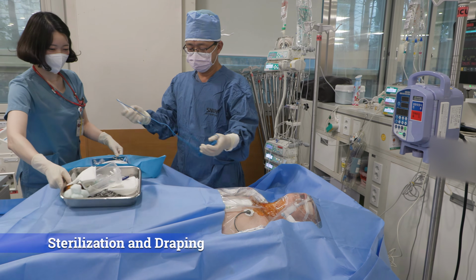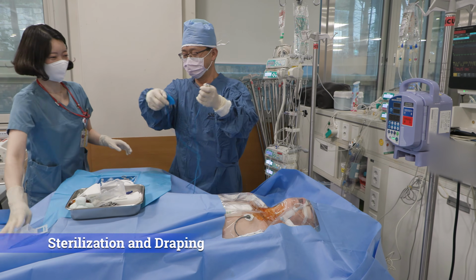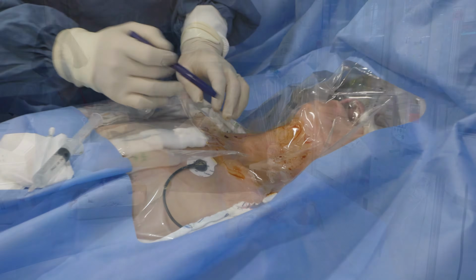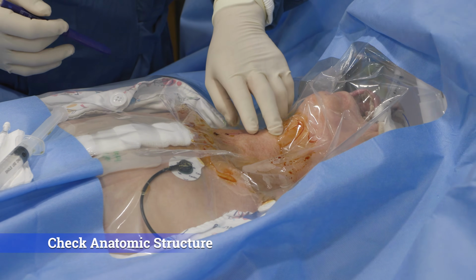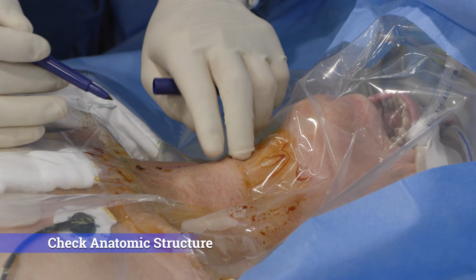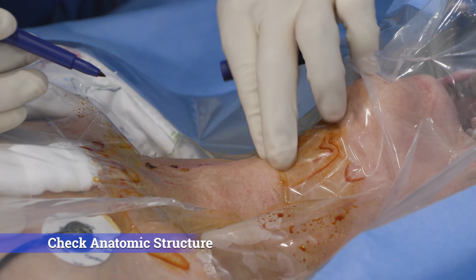During the preparation phase of the PDT procedure, it is important to ensure adequate neck extension when positioning the patient. Before performing PDT, it is advisable to review a CT scan that includes the neck region, or use ultrasound to check for any veins running anterior to the trachea.